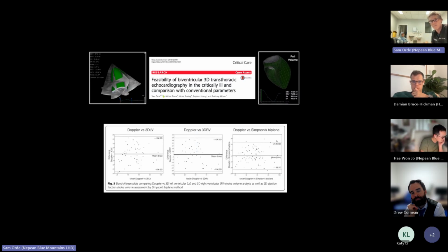So we had to try to have a look at it, and again, I couldn't exactly do it versus MRI, but I used stroke volume measured by Doppler as the reference standard. It's not the perfect way to compare it, but generally that's pretty accurate, and I'll show you some data in a sec. It's pretty precise as long as you're well trained, and I hope I was okay for that. So I used that as the reference standard, and I compared 3D volumetric analysis of both the LV and the RV. If you look at the Bland-Altman plot on the left, the errors in terms of stroke volume assessment were plus or minus 15 to 20 mils, which when you're looking at a 60 mil volume, is quite a lot, I thought. So I felt it lacked precision and lacked agreement when we did this.